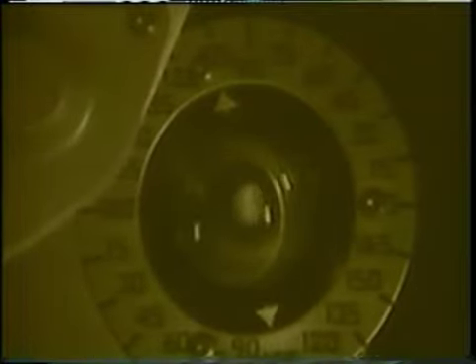A projected letter can stimulate accommodation, and large bright fixation targets produce annoying reflections in the corrective lenses. There is no way to avoid entirely the reflections of the retinoscope light in the phoropter lenses, and one simply has to move slightly to one side or the other to see past the reflections.